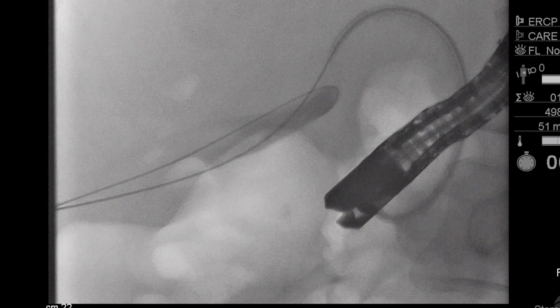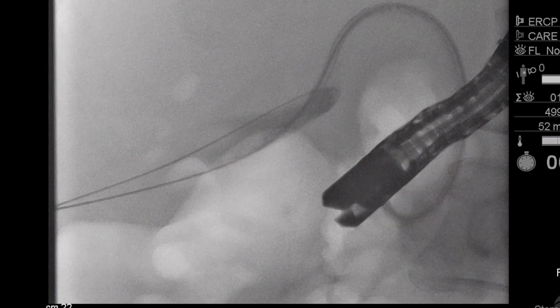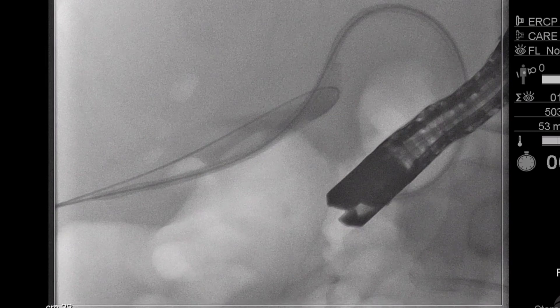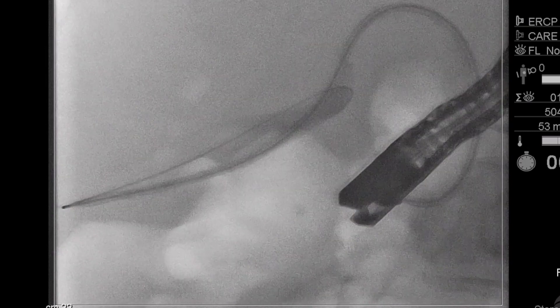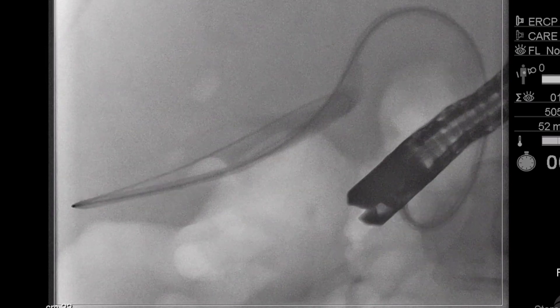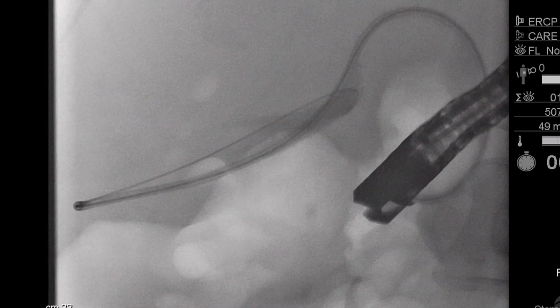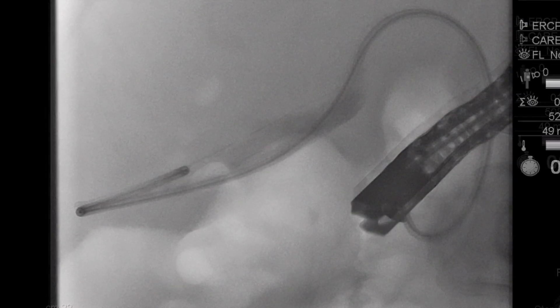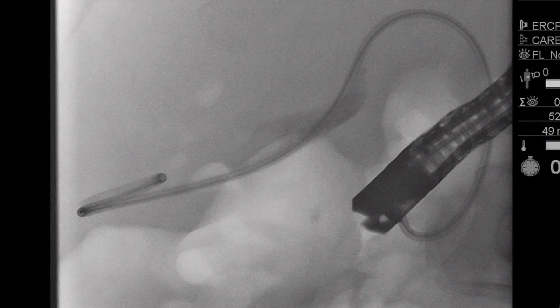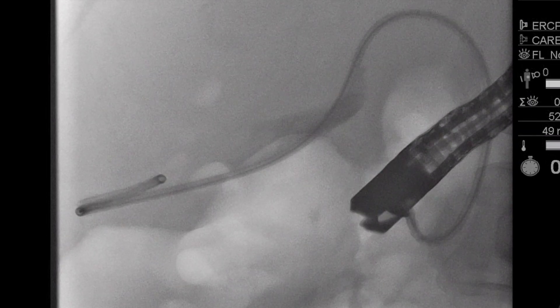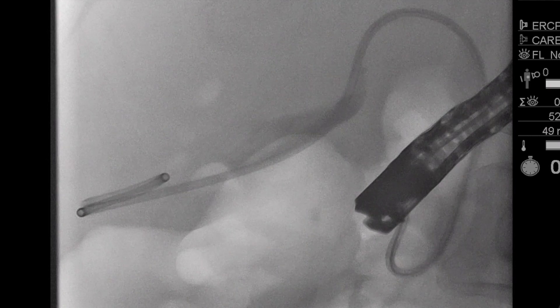After dilation and determination of stent length, a double-pigtail plastic stent can then be advanced into the gallbladder. While data suggest a single stent can be adequate to treat patients with cholecystitis, it is our practice to attempt to place two stents in parallel to provide definitive management and prevent re-obstruction if one stent were to become occluded.